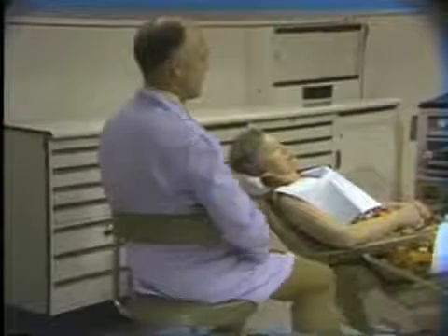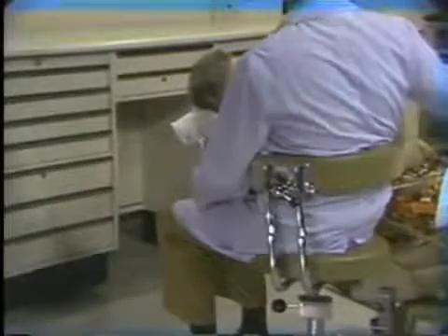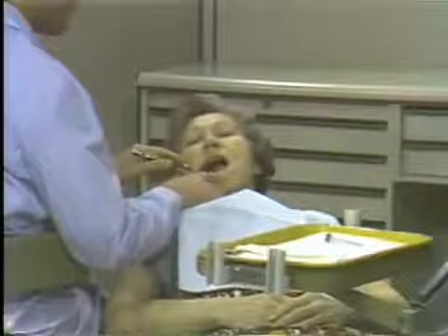Now to get into the correct position, the operator will come in at about the 7 o'clock position. Get the knees together and behind the chair. And from here, you should have a good view onto the lower right quadrant. You will note that the elbows should drop down beside the operator. Hands and elbows are at about the same height. Now, you can open and we'll have a look into the lower right quadrant.